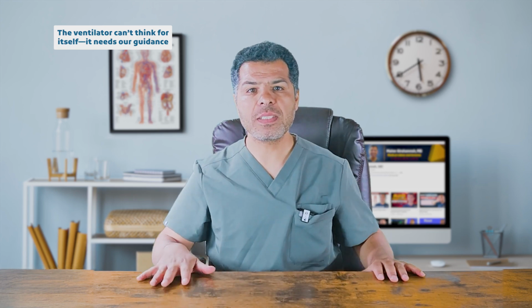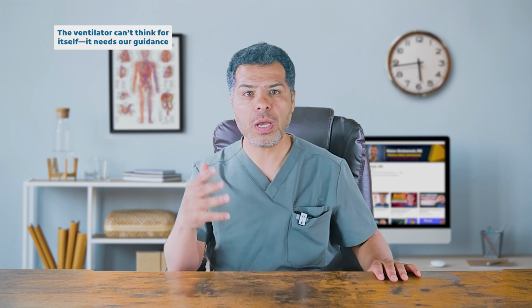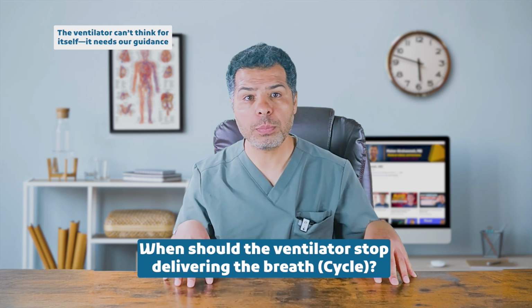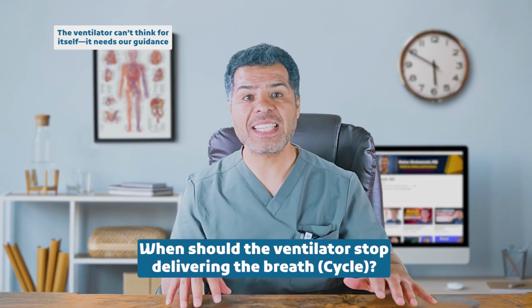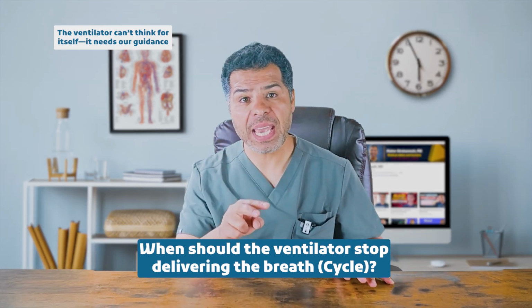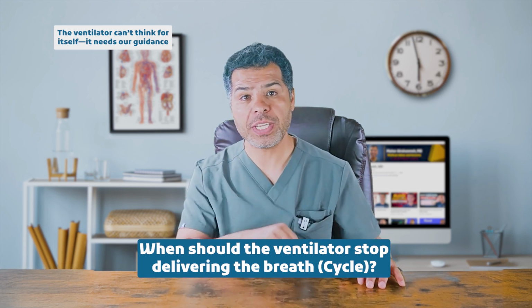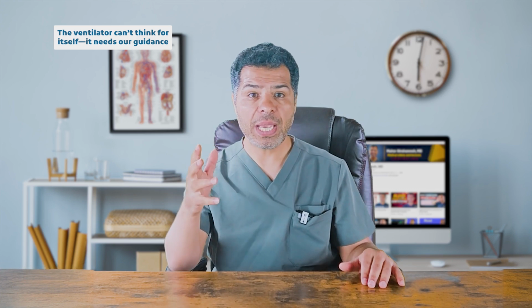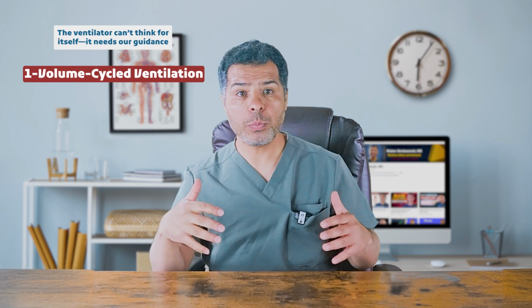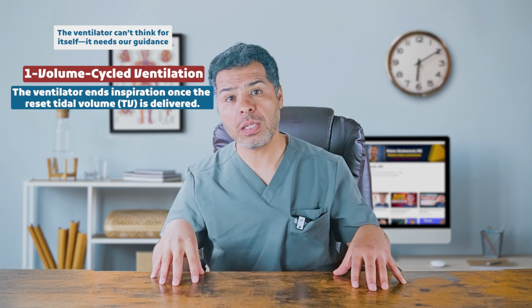Now, having discussed when the ventilator initiates a breath, the trigger, and how the breath is delivered, the target, let us now turn our attention to when the ventilator should stop delivering the breath, a phase known as the cycle in mechanical ventilation. In mechanical ventilation, there are three main mechanisms to determine when the ventilator stops inspiration and switches to expiration. These cycling mechanisms are: number one, volume cycle ventilation. In volume cycle breath, the ventilator switches from inspiration to expiration once the preset tidal volume is delivered.